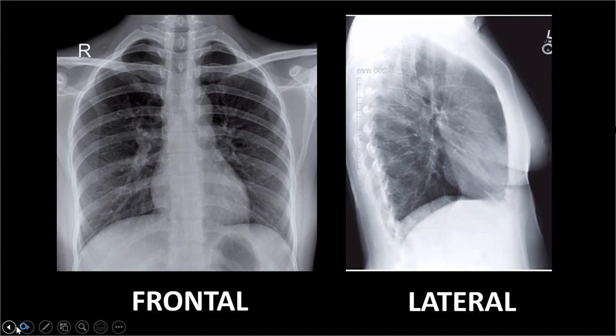But usually, clinicians don't request those, not unless the radiologist would advise that those certain ancillary procedures, the anteroposterior oblique or the posteroanterior oblique, right or left, should be done. But nevertheless, it's safe that when you are suspecting a cardiomegaly with a particular chamber, you can do an ancillary examination, a lateral view, in order to further evaluate the condition of the heart.